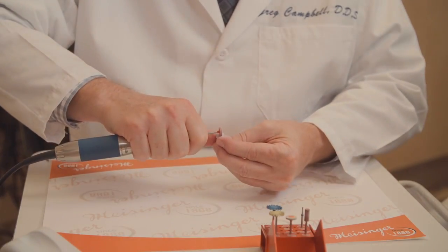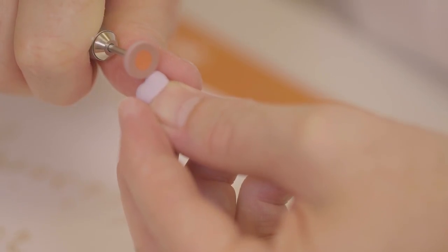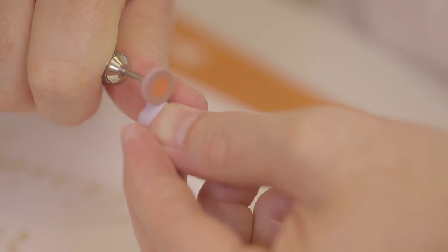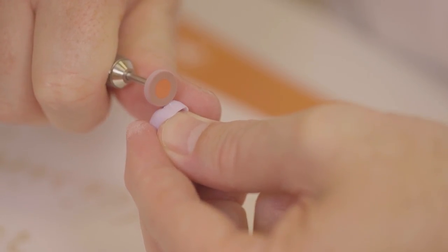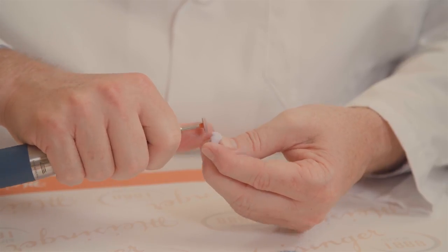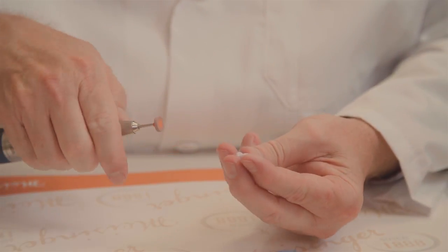So I'm going to come on here, about 10 to 12,000 RPM, medium pressure, not heavy pressure like you use with paste. You're going to protect your margin with your thumb like I'm doing here, if you're right-handed. And just going to let the wheel go in and start to polish. You can already see that it's starting to take on somewhat of a semi-gloss appearance there. Go on to our lingual. I'm just going to let this pre-polish wheel work for me. Once I've done that, I'm going to come onto my occlusal surface, go into the areas that allow me into, and we're done with that.